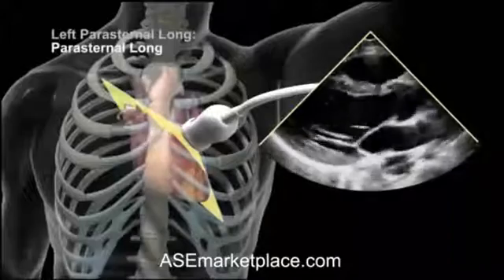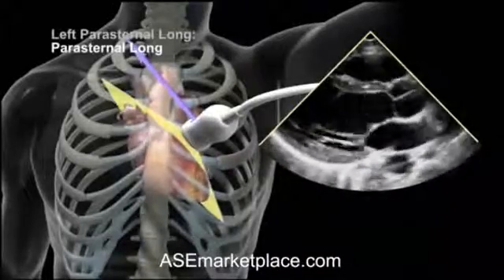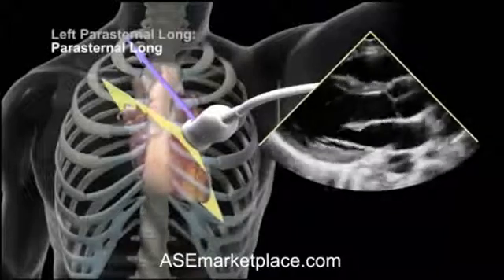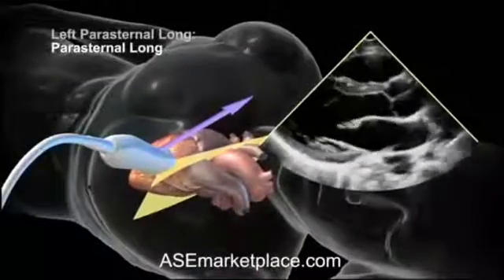Simply called the parasternal long view. To acquire this view, the transducer indicator is aimed to face the patient's right shoulder. From the perspective of the sonographer, we will now demonstrate the relationship of each of these three views.